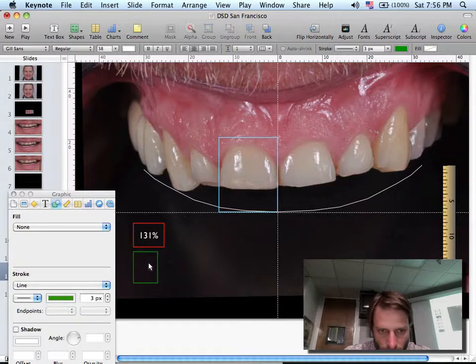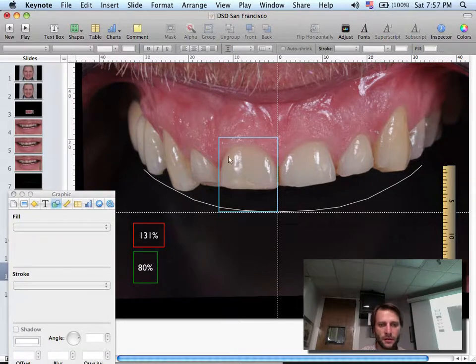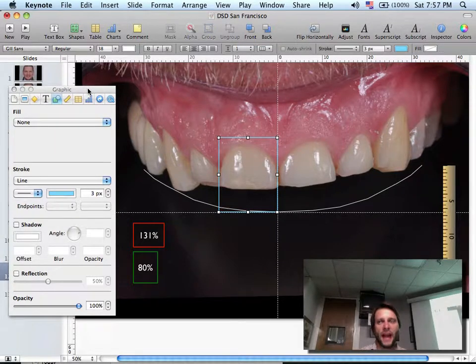This is 80. And then the final analysis is, what did I write on the other one? The acceptable. So now I already know the actual proportion, I know the relation with the ideal, and I want to adapt to his reality and see what kind of proportion we will end up.